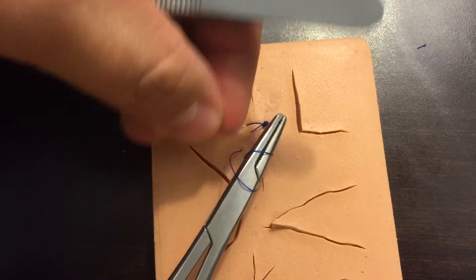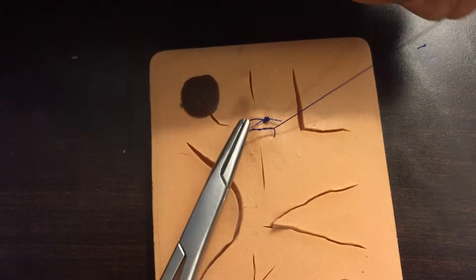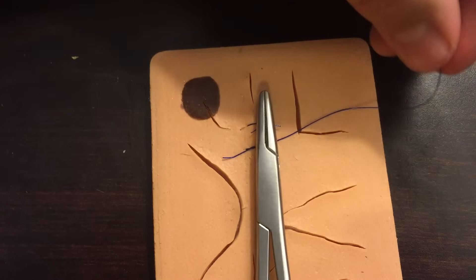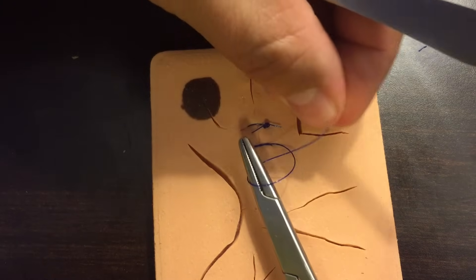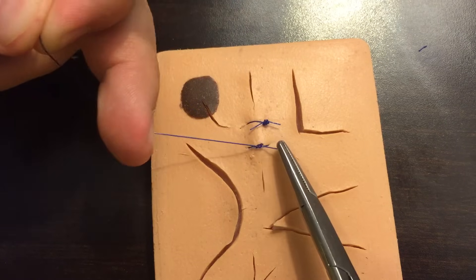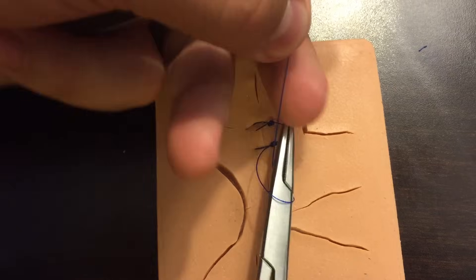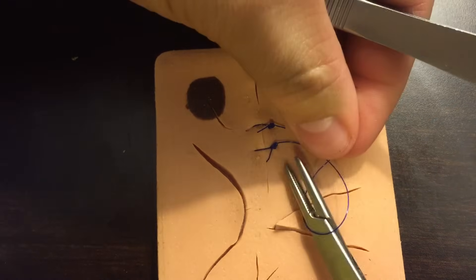Needle driver in the middle running parallel with the laceration. Left hand goes over the needle driver twice for the first throw, grab the tail, and because my hand is on the left I pull it to the right side, snugging it down but not too tight — too tight will strangulate the skin and cut off blood supply. Come back again, needle driver in the middle over the top, grab the tail, hand on the right so I go to the left, creating the square knot. Pull to the side, repeat once more for good measure.